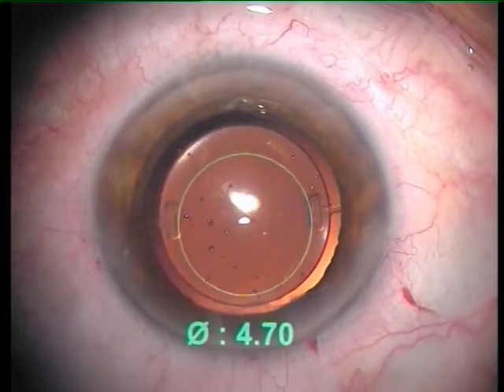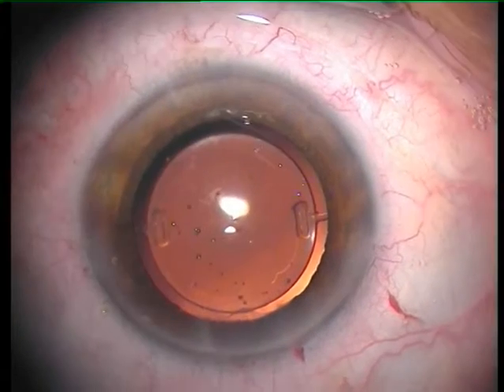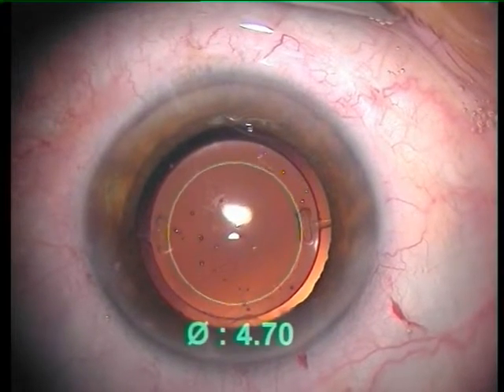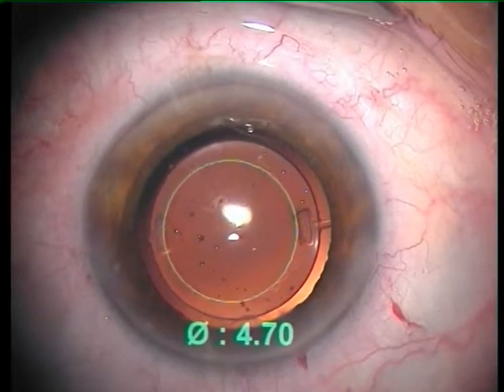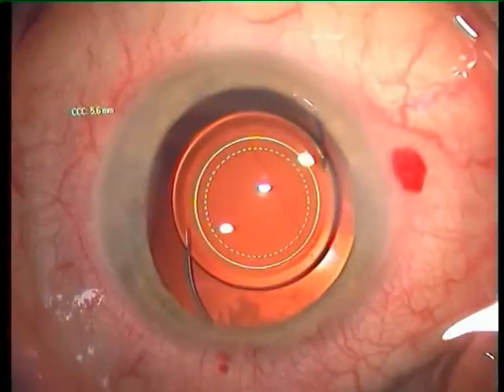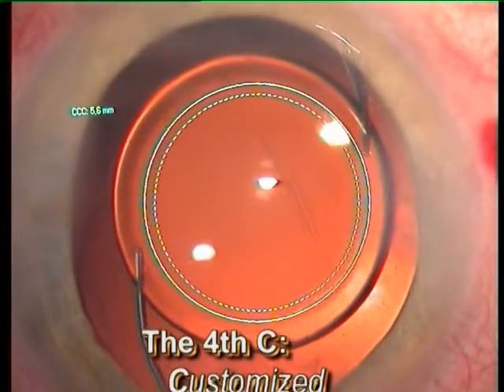Both the resident-in-training, as well as the experienced surgeon, will profit from this data projection, which will prove to be a major objective intraoperative aid for the optimisation of the surgical outcome. The resulting customised CCC will help us to achieve our ultimate goal: complete patient satisfaction.